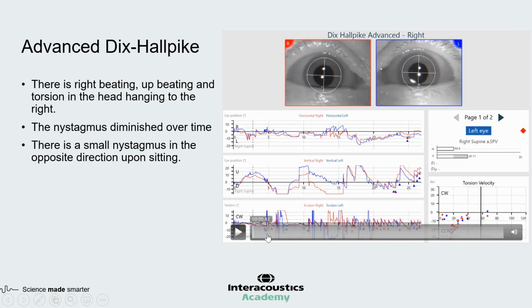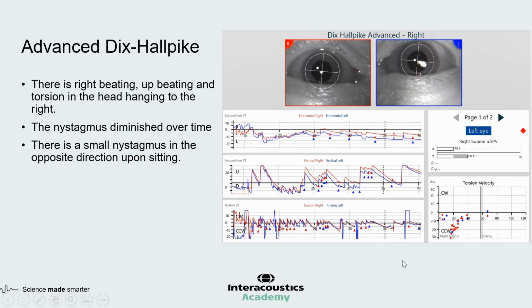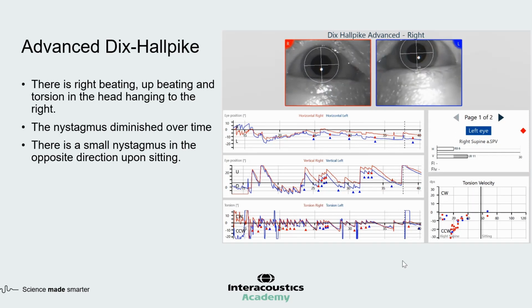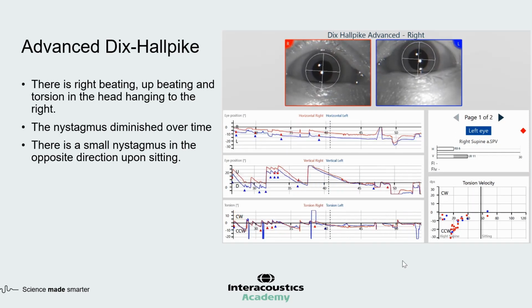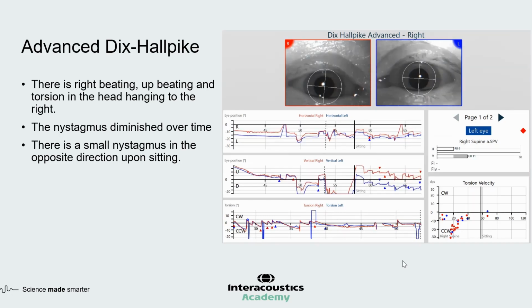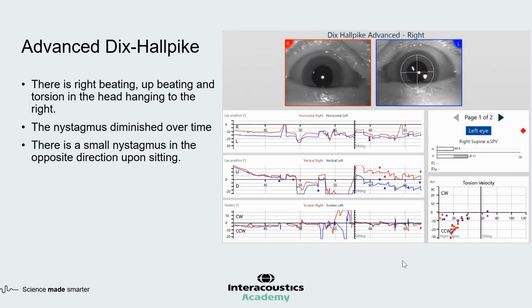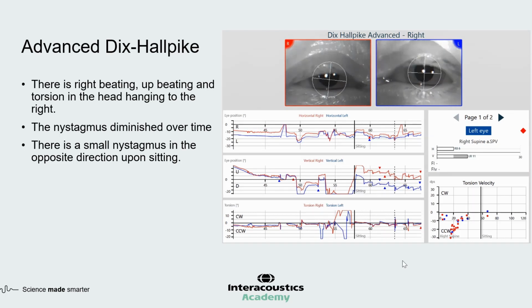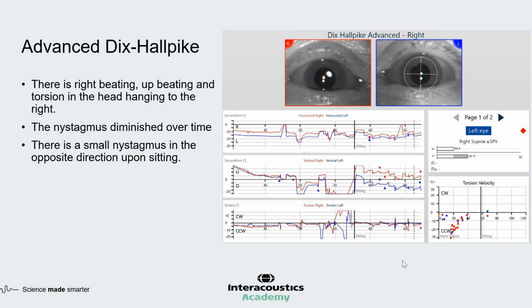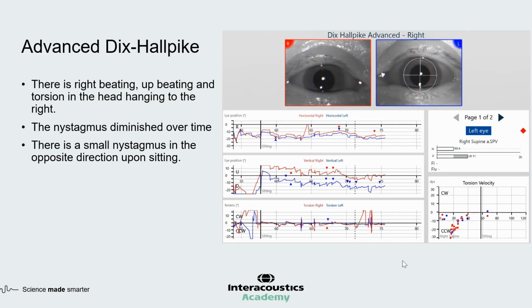If we go back to this video and fast forward it a bit, you'll see that after about 35 seconds or so, the response starts to slow down. That's a very good indicator that this is BPPV triggered by the movement of these crystals, because the crystals have now settled down due to gravity, so there's no nystagmus. But when I sit her back up, you can see that the nystagmus returns, oftentimes in the opposite direction and not as strong. This is usually a result of those crystals falling back down when she sits up again. So she meets all the criteria for having BPPV.